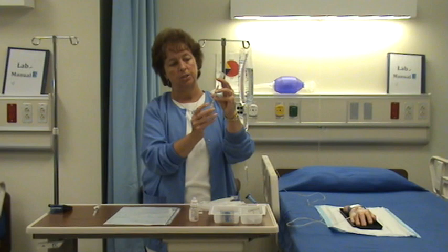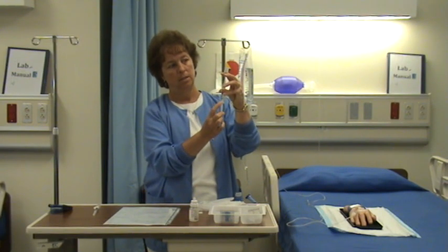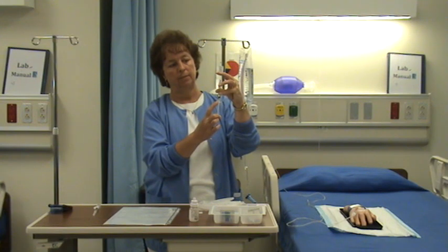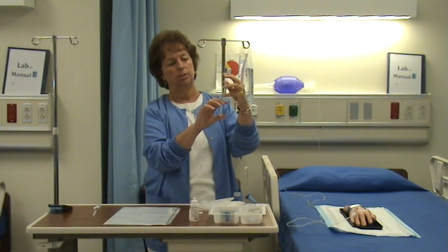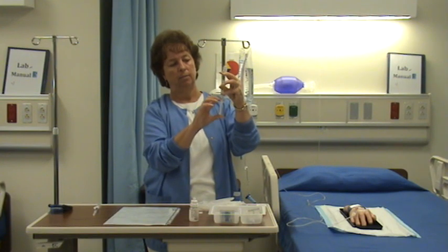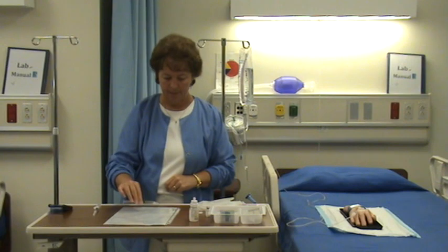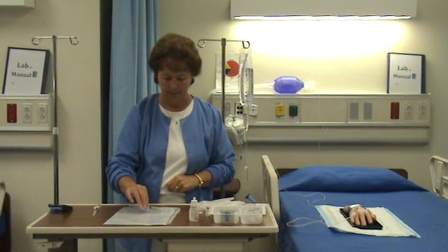And I'm going to just draw out basically the whole vial, because it's 20 milligrams in this vial. It should be 2 milliliters, and it is. Give it some of that air. I'm going to recap that with one hand, because it's a needle.